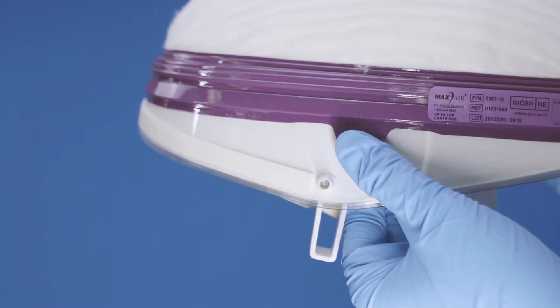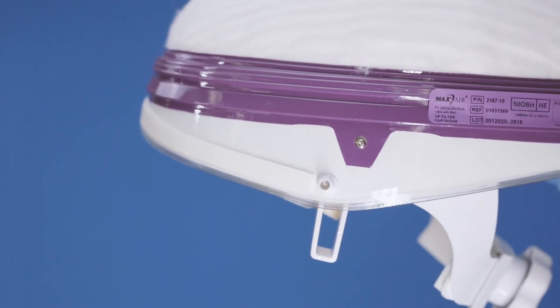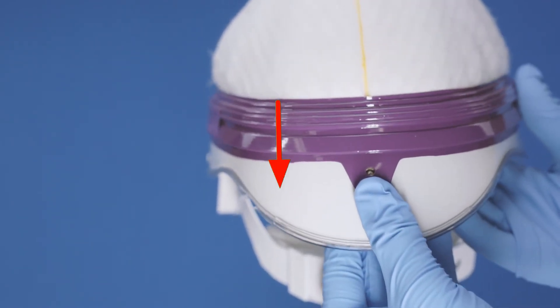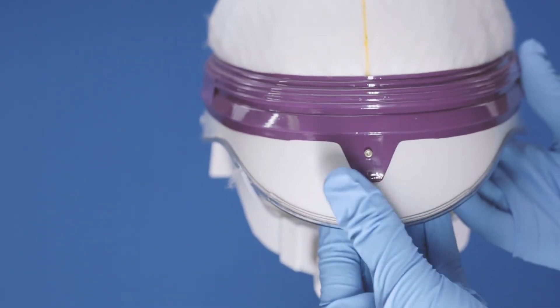When the side tab holes are over the helmet snaps, snap them to the helmet. Typically starting at the rear, roll your thumb over the rear tab downward while pressing inward to snap it onto the helmet snap.